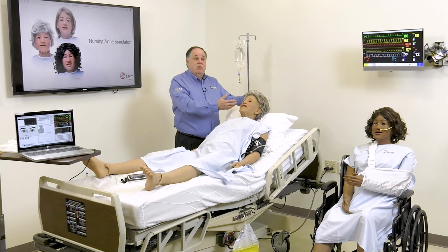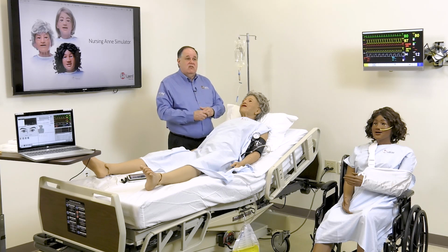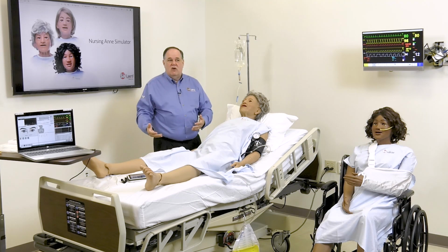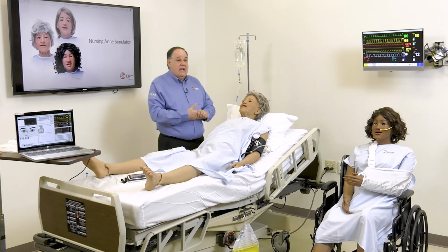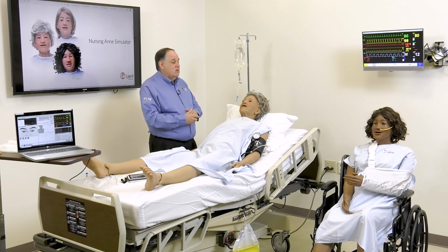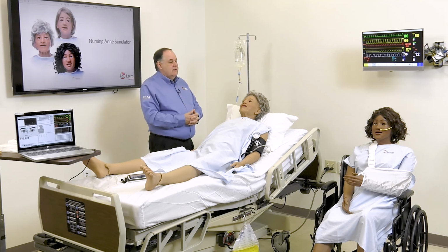So again, you could have multiple wigs to set multiple settings. So maybe you want to have a wig that's matted and not cared for. Maybe the simulation you're trying to get across is an elderly person in a home care environment that isn't able to look after themselves. How do we get that message across? It's through the subtle cues like the hair, right? Things like that. And we'll talk about other cues as we go through. But think about the wig as being able to ramp up the fidelity of the experience.